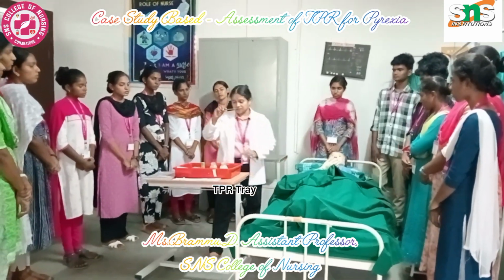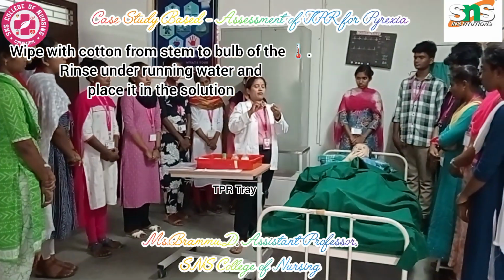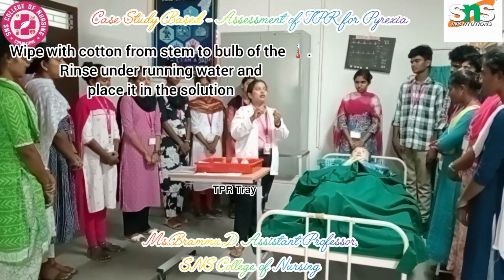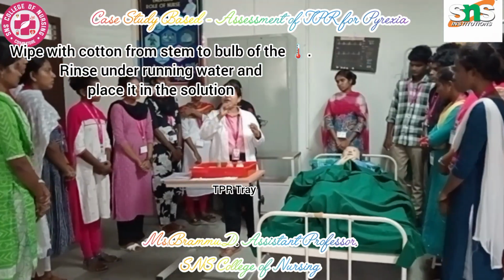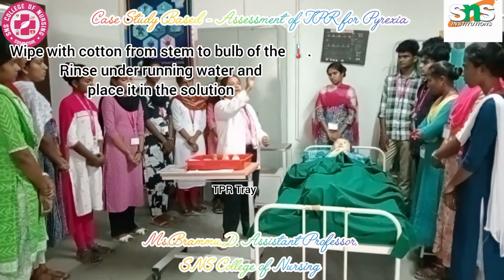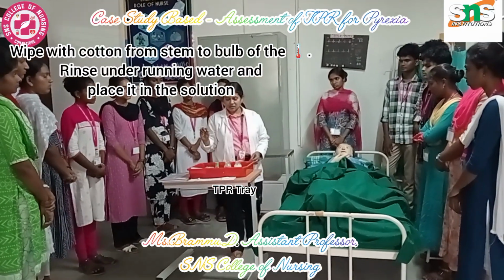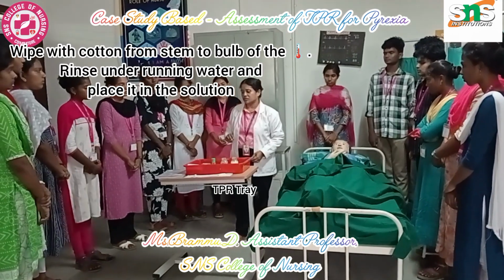Then again you can rinse it. First, what do you have to do? Before keeping it in the patient's mouth, wipe from bulb to stem. After you take it from the patient's mouth, wipe from stem to bulb, in a rotatory fashion. Put it under the light source, check the temperature and then disinfect. Put it into the disinfecting solution.